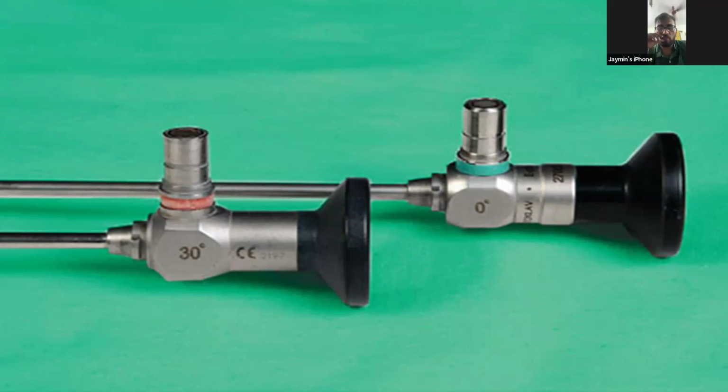So this image shows a 0 degree telescope and a 30-degree telescope. But what are the degrees? 0 degree means that the lens is straight in line. It is not angulated. So it is mainly used for urethroscopy. So straight in line vision. Whereas a 30-degree cystoscope has an angle of the lens in the front of 30 degrees. So basically, it can be rotated to view the lateral surfaces of the bladder. So that is with regards to the degree.